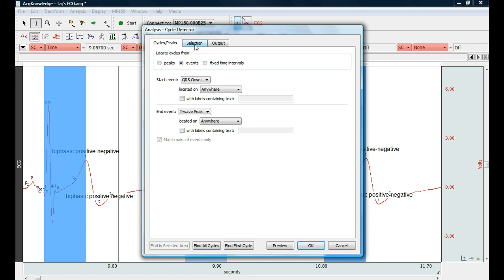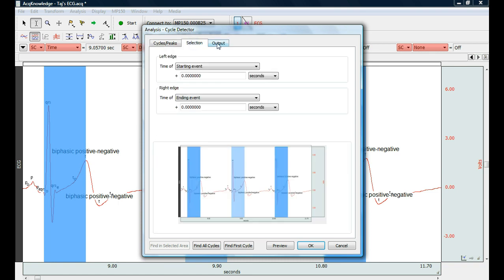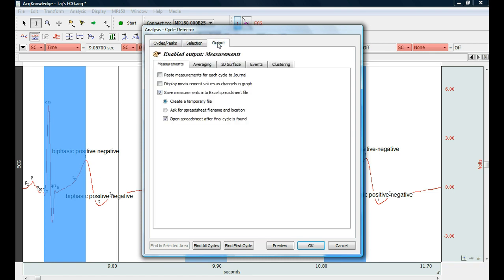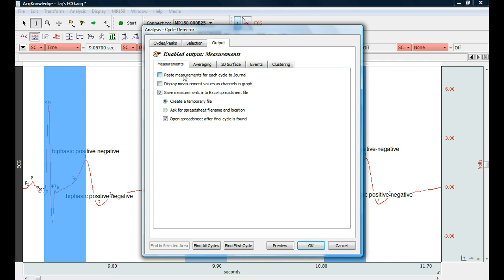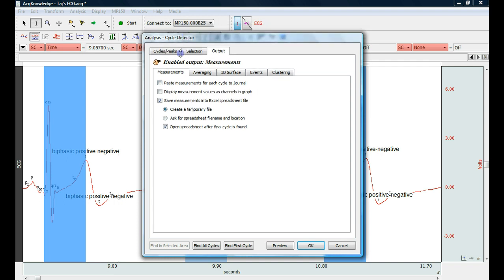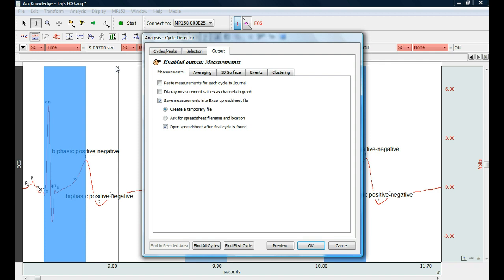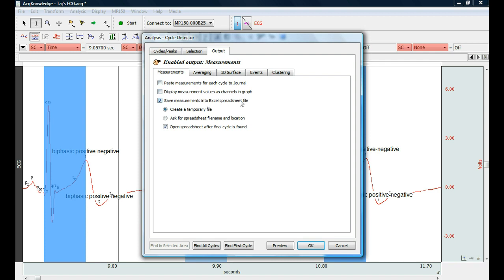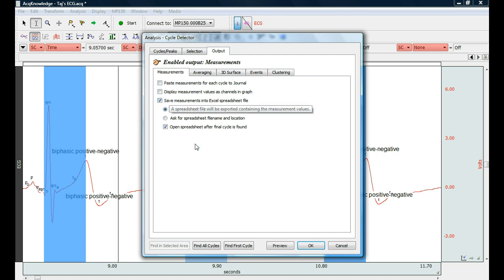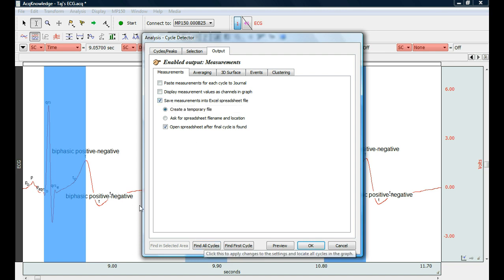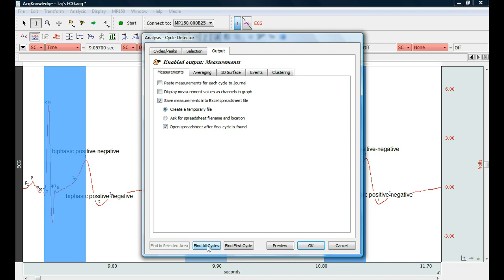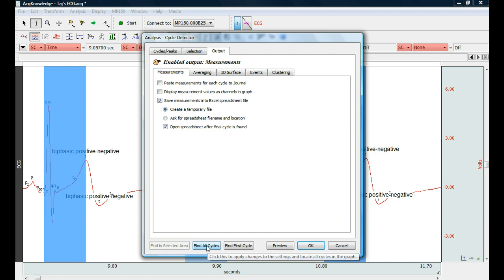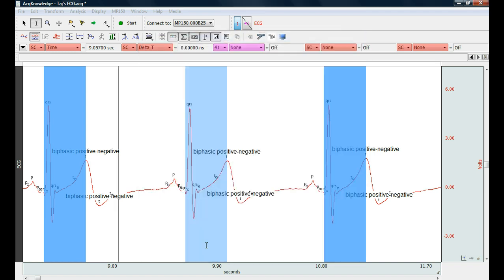And you can leave selection, find, go to output and you can either dump these measurements, the measurements that are up here into the journal or into a new graph or into an Excel spreadsheet. I'm going to choose the last one Excel spreadsheet. And I'm basically ready to run it and I can select find all cycles.